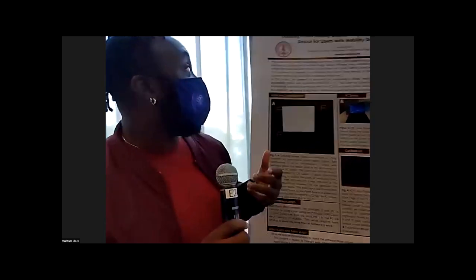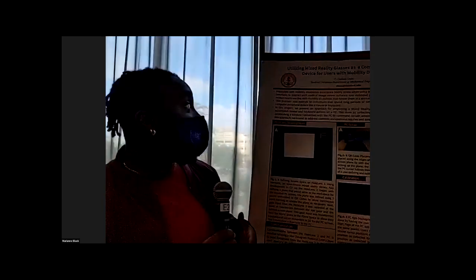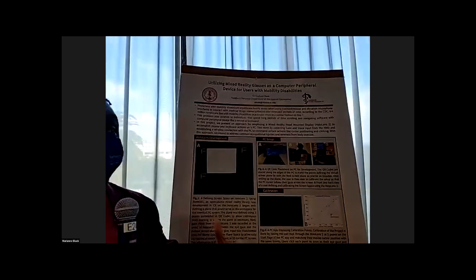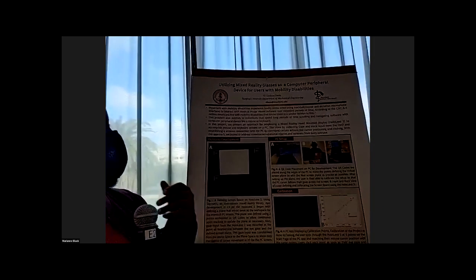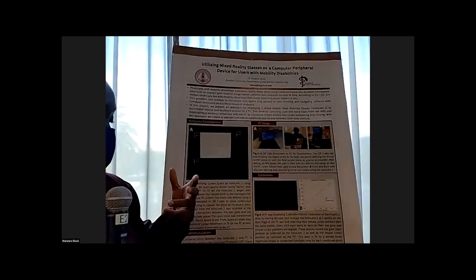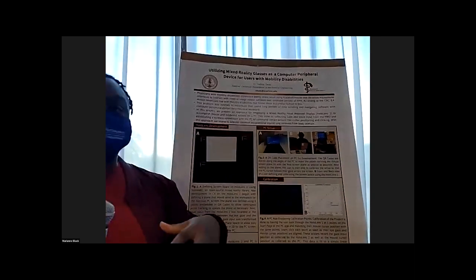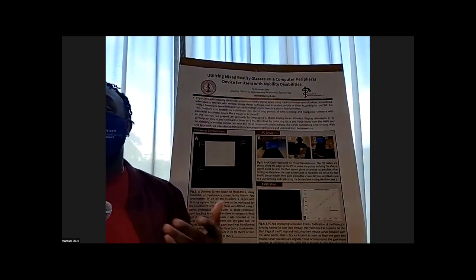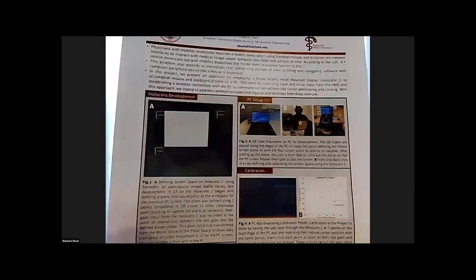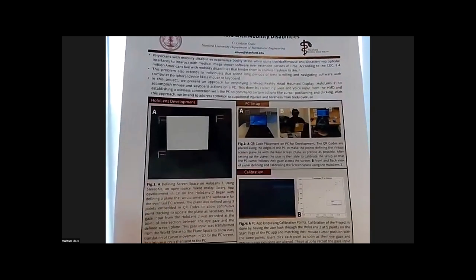So the project we have here is around using the HoloLens or mixed reality glasses in general to communicate with your computer and perform day-to-day functions like cursor positioning, clicking, and things like that. In particular, we were drawn to this project after observing people with limited mobility struggle with using their mouse, trying to click all day because it does cause body strain over an 8-hour workday. So we're trying to see if we could use the readily available information from the gaze and voice input from head-mounted displays to control what you see on your screen.